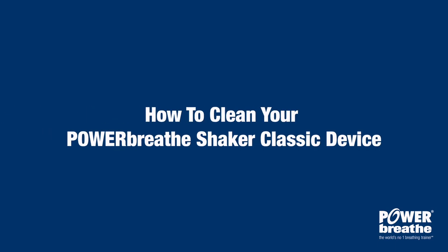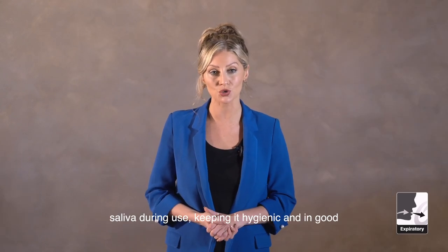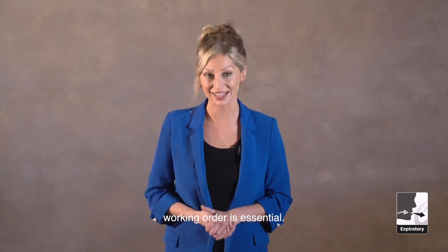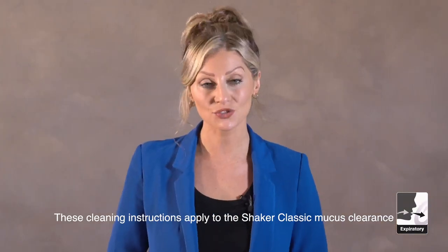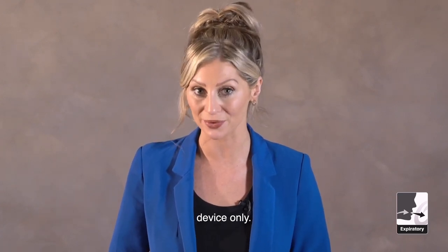How to clean your PowerBreathe Shaker Classic device. Because your PowerBreathe Shaker device will be exposed to saliva during use, keeping it hygienic and in good working order is essential. These cleaning instructions apply to the Shaker Classic device only.